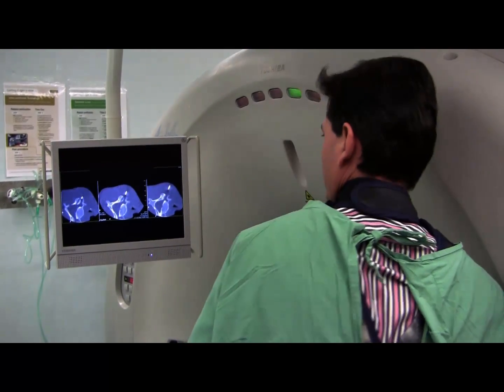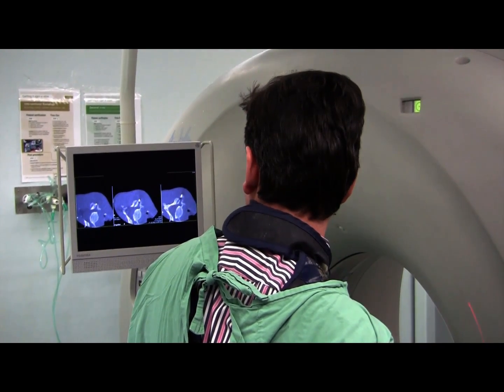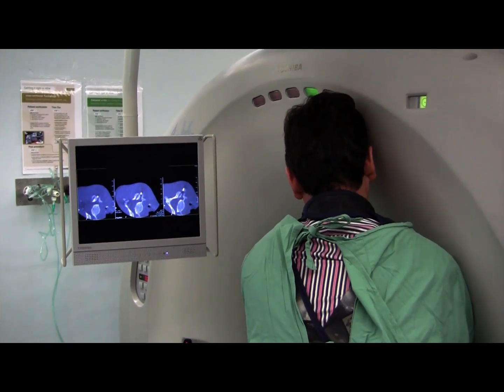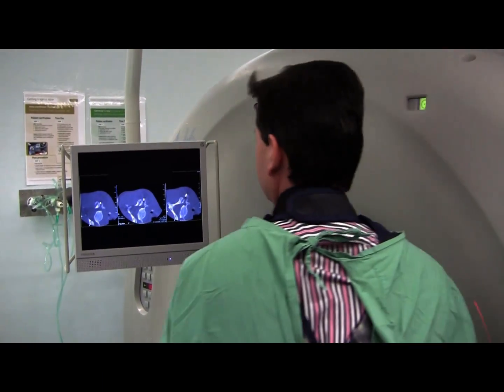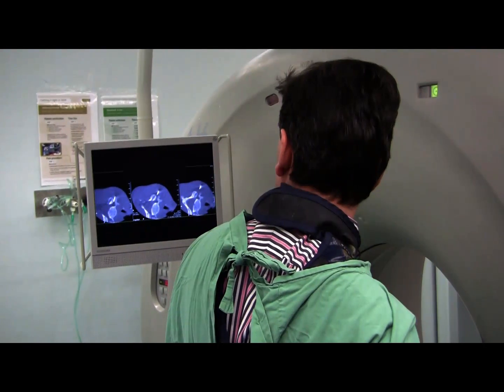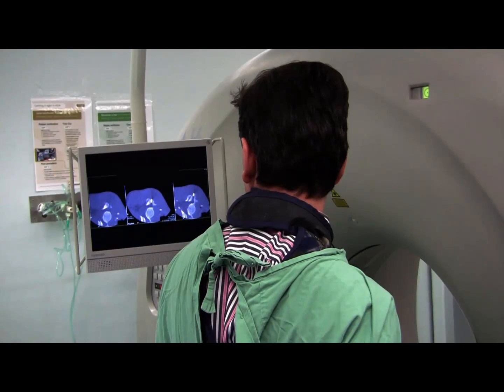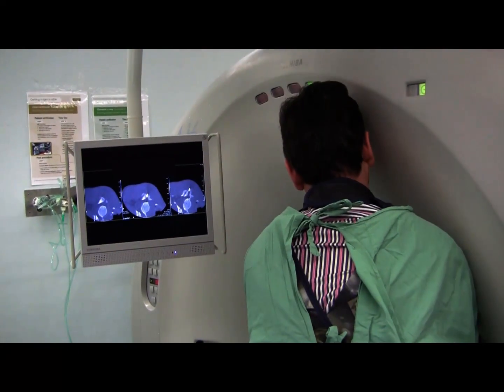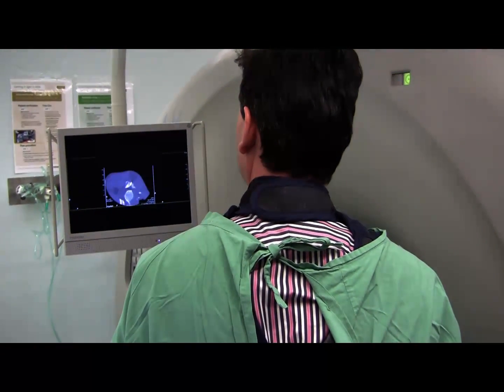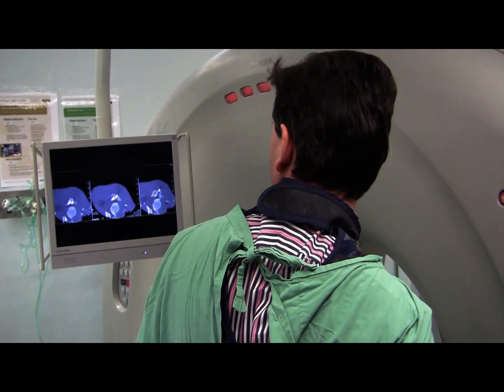The next view is from the other end of the gantry, looking in over the patient's head, where you'll see me testing that needle. Once I've got the needle in what I think is the correct position, I'll take the stilette out to be sure we're not getting back any blood. If you get any blood at all, it's usually venous, but there is the possibility the tip is in the vertebral artery. With a 25-gauge needle that's not actually the end of the world, but it's not what we're aiming for. If we saw venous blood, that would be an indication to do a contrast test. If the stilette comes out clear and we're fairly sure the needle tip is in the right place, I usually test the position with a little bit of local anaesthetic to see if we can produce numbness down the arm. If that local anaesthetic test has worked and there's numbness down the arm, then and only then do we finally inject the steroid and local anaesthetic.